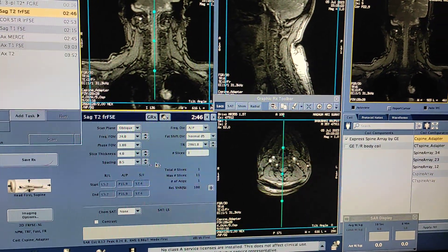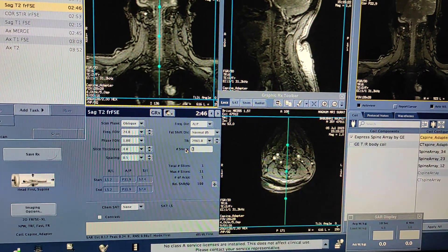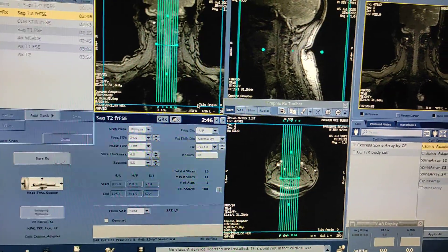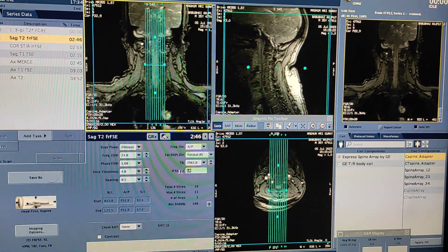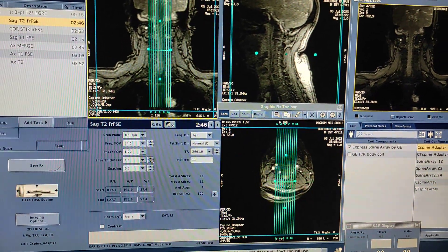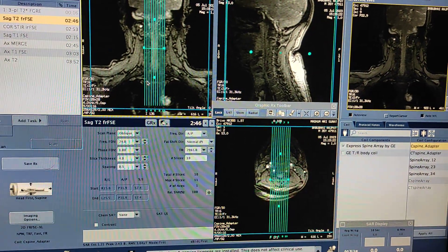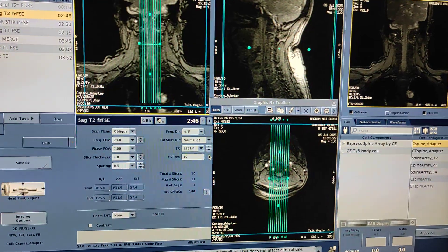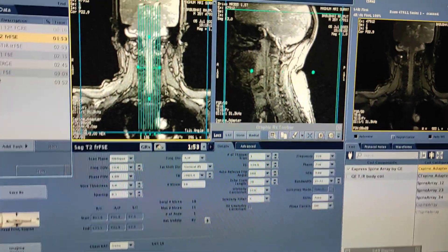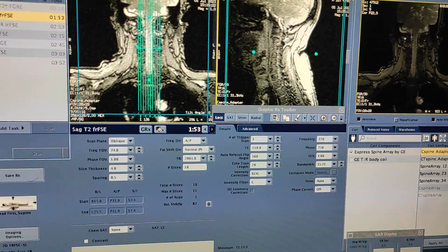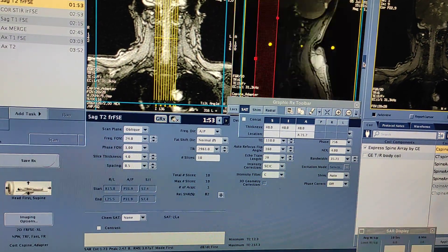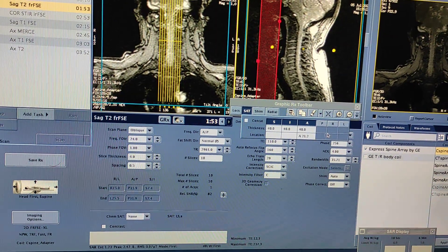Then you have to cover from right to left — transverse process to transverse process — meaning you have to cover the foramen. I am taking 10 slices; my right-to-left region has been covered. Don't miss the foramen. Some people take only 8 images — that is not advisable. You can take 10, 11, or 12. Fewer slices means less scan time. For sagittal T2, you should keep a sat band anteriorly to suppress anterior artifacts, but here I am not keeping one.